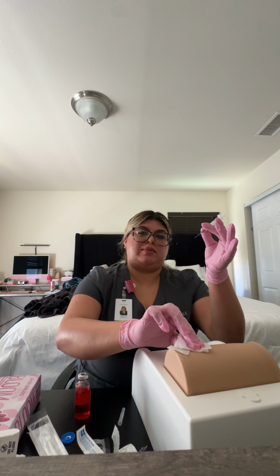We're going to gently just remove the needle. Without recapping it, we're going to throw it in the sharps container. We're not going to apply too much pressure on there. And then we're going to go ahead and answer any of the patient's questions.